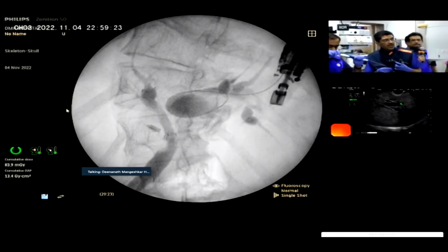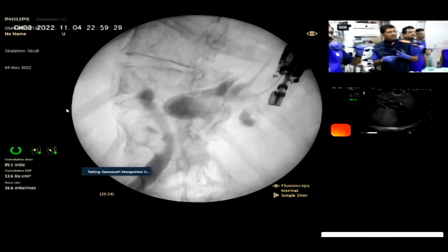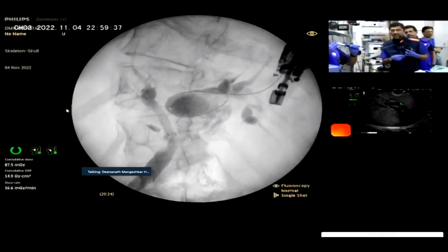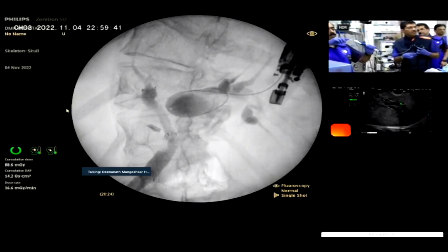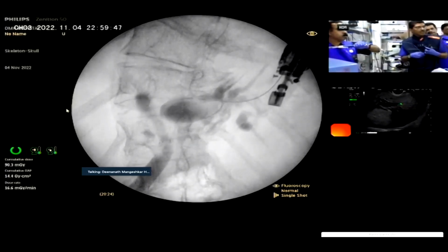What we need to do here is keep the fluoro in view at all times. That is the first thing. Secondly, once the wire runs out, as you can see, Vilas will start flushing the end of the needle with saline, so as to maintain the pressure and prevent the needle from slipping out.